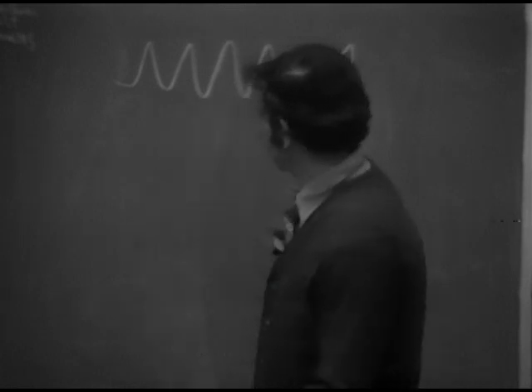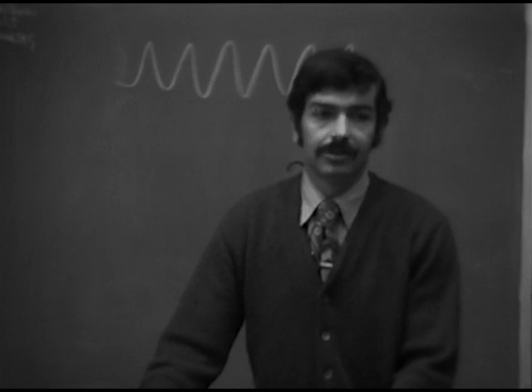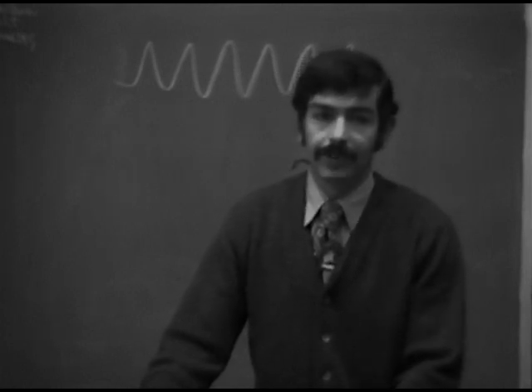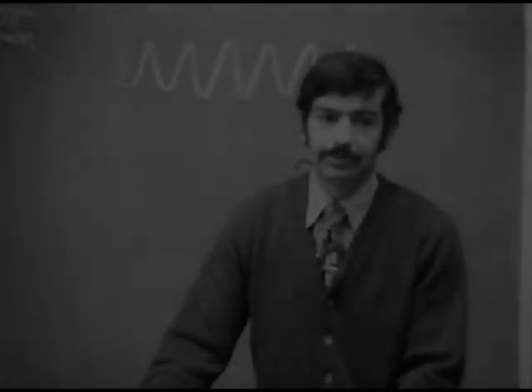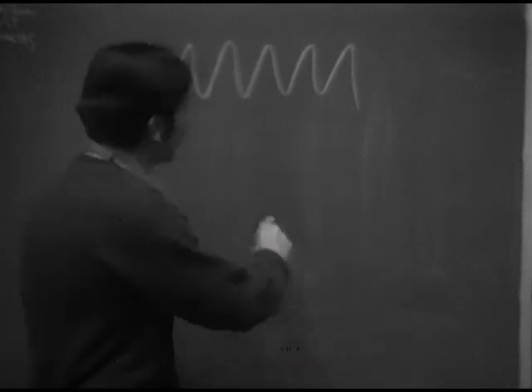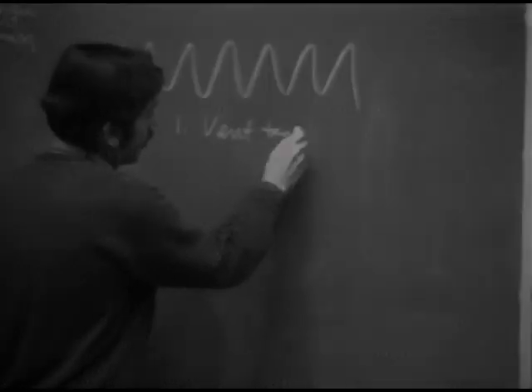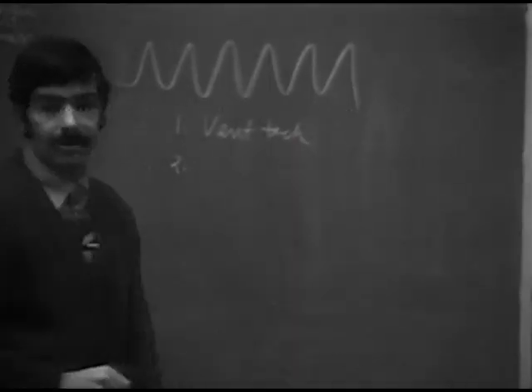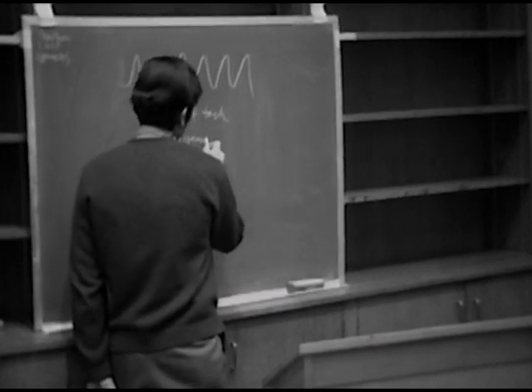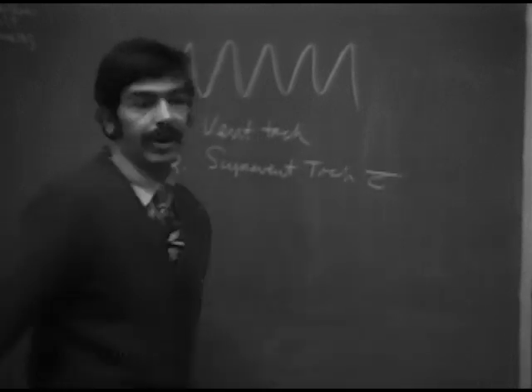Now, when we all look at this, we might right away think that this looks very much like ventricular tachycardia. But that's the question: is it really ventricular tachycardia? What else might it be? It may not necessarily be ventricular tachycardia. One possibility certainly is ventricular tach, but another one is supraventricular tachycardia with a wide QRS complex.